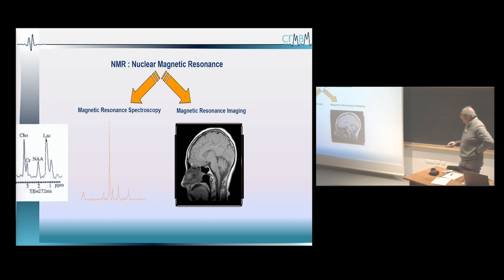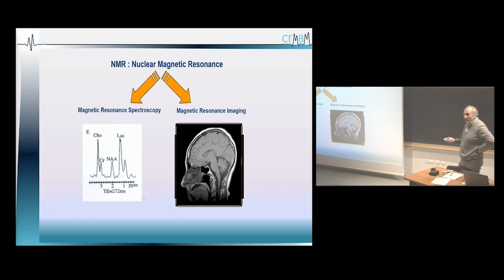If you want to do spectroscopy, of course, you can also do spectroscopy of brain. And in here, it's not phosphorus spectroscopy, but proton spectroscopy. And in here, you don't see water and fat, because for the metabolism, it's not so interesting to look at water and fat. So you are going to look at all the metabolites with protons. You have lactate, choline, creatine. But in order to do that, you need to eliminate the signal of water, because the signal of water is so big that you wouldn't see these metabolites if you don't suppress the signal from water.